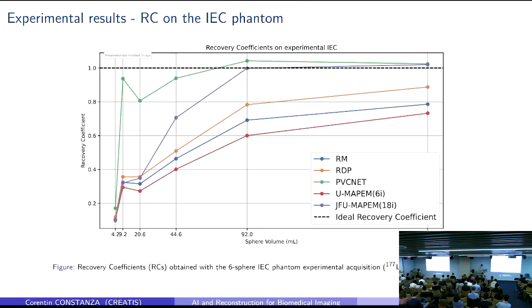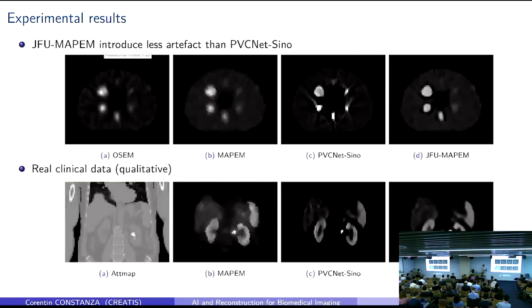And these black box pre-processing methods introduce a lot of artifacts, as you can see. There is a lot of stray artifact there and there. There are also some artifacts with Jacobian-free unrolling, like an inverse Gibbs artifact, we call that, but we don't really know why, but they are less pronounced.